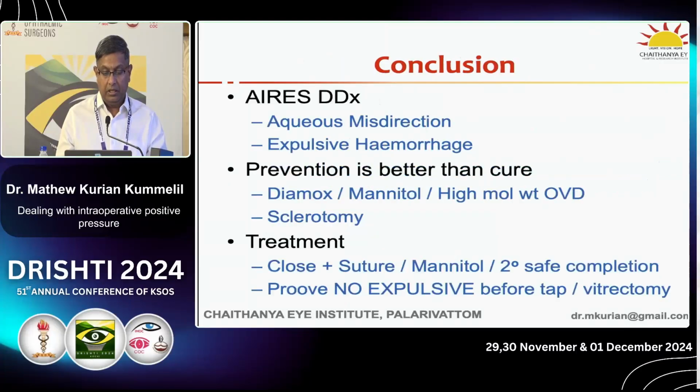And my take on this condition, which is acute intraoperative rock hard eye syndrome: the differential diagnosis is aqueous misdirection, which we would like to happen, but which happens much less frequently than we believe. And we believe that expulsive can never happen to us. It happens only to other people. Okay, so think that it is expulsive that's happening to you.